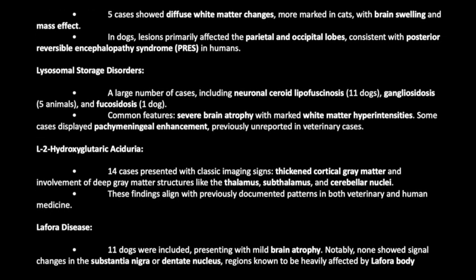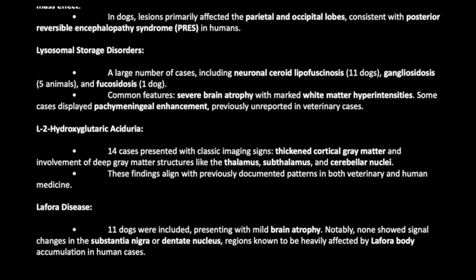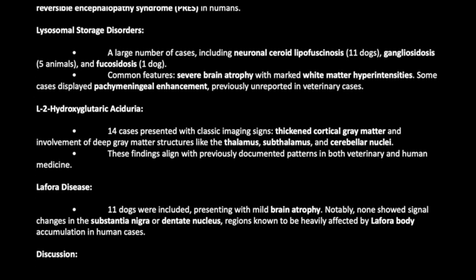Lafora disease: 11 dogs were included, presenting with mild brain atrophy. Notably, none showed signal changes in the substantia nigra or dentate nucleus, regions known to be heavily affected by Lafora body accumulation in human cases.